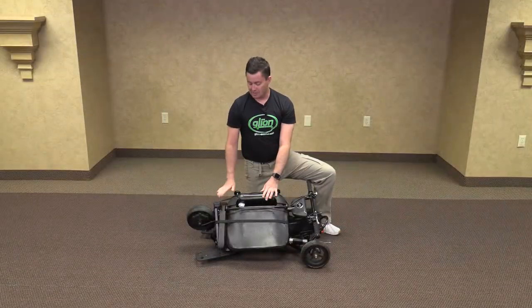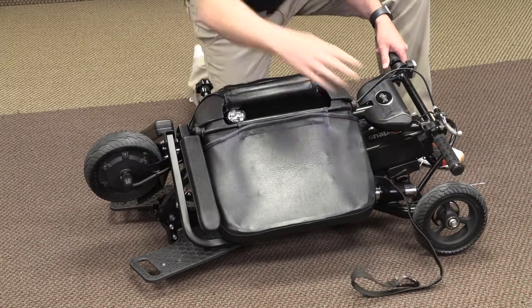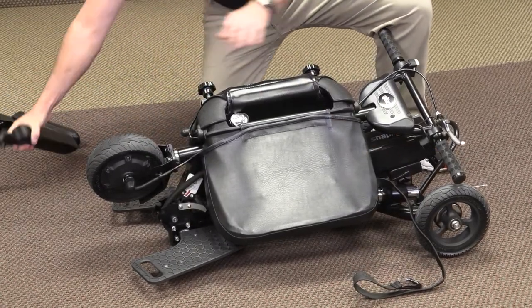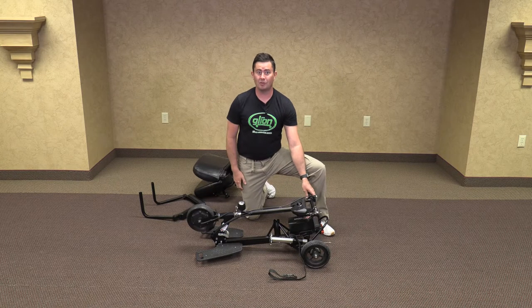Now we will remove the bungee which secures the seat to the scooter. And we will remove the armrests and the seat. Now we are ready to unfold the scooter.